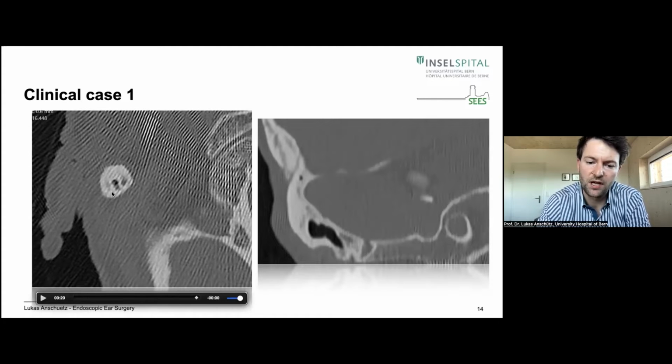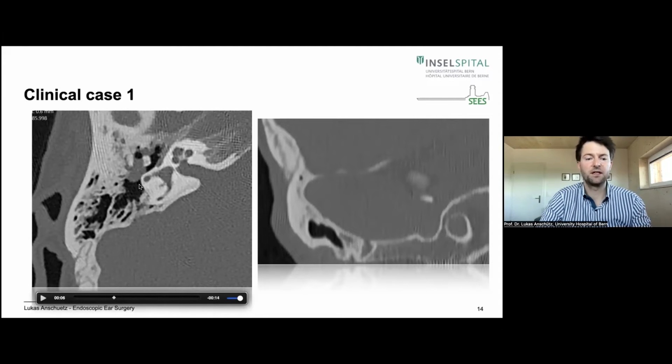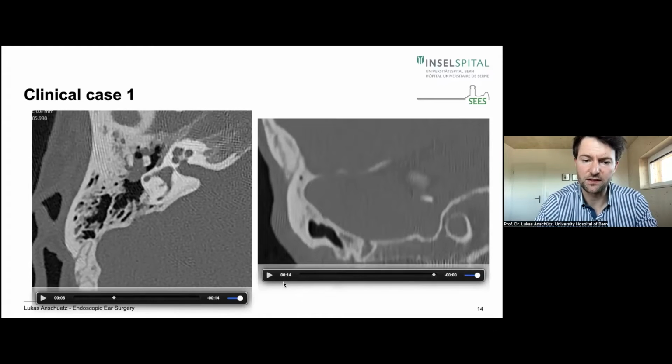So I planned for her an endoscopic removal of the cholesteatoma. And when I do cholesteatoma surgery with the endoscope, you can imagine that this might be a cholesteatoma which you can remove very well through the canal, because the size does not go posterior to the lateral canal. But you never know, it might be bigger, it might be a problem with removing. So I always explain to the patient, and if we need, we will do a retroauricular approach, drill away the mastoid and completely remove the disease. I think this is the most important thing for the patient.